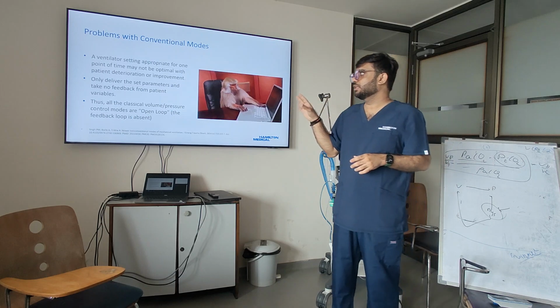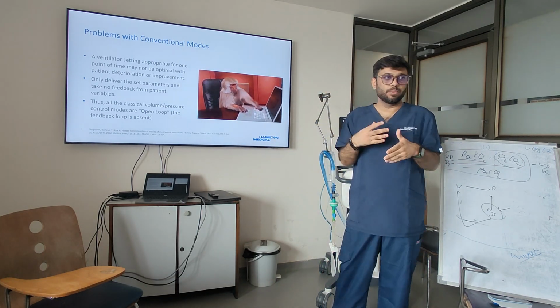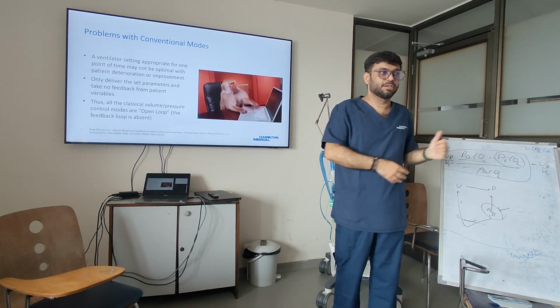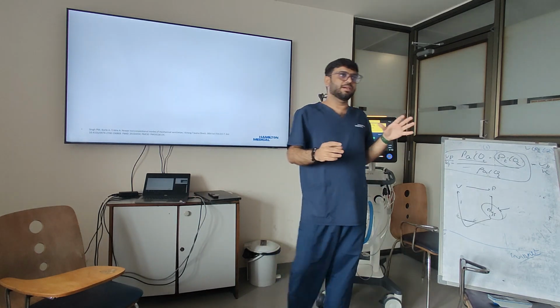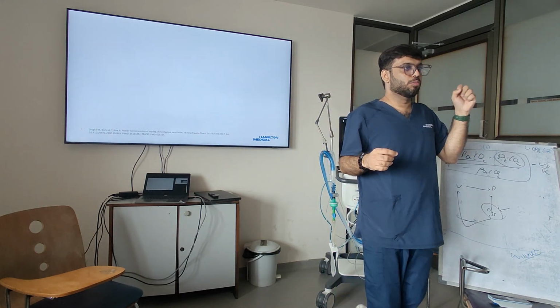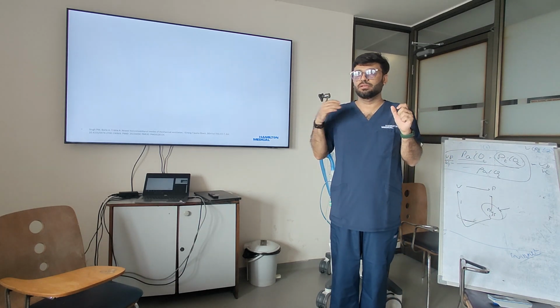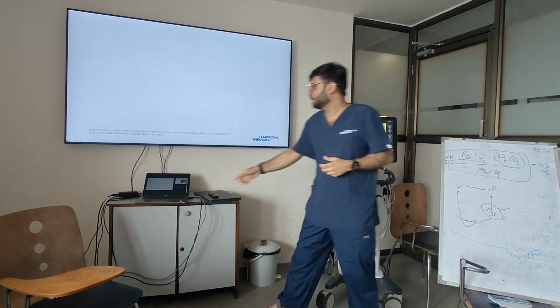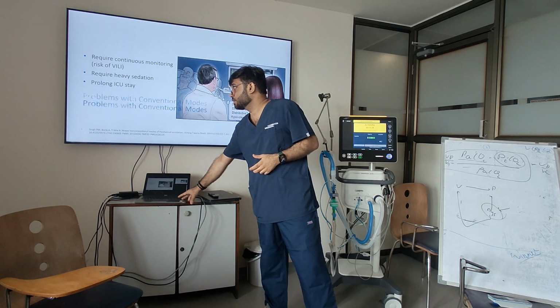Now, all the classical volume and pressure control modes are open loop modes, which have no feedback, and you as a clinician fill that loop, as I explained. Actually it's not a problem, but it requires more intervention and more monitoring. You have to be there for a long time to see the change and then operate accordingly. It of course requires continuous monitoring, as I mentioned.